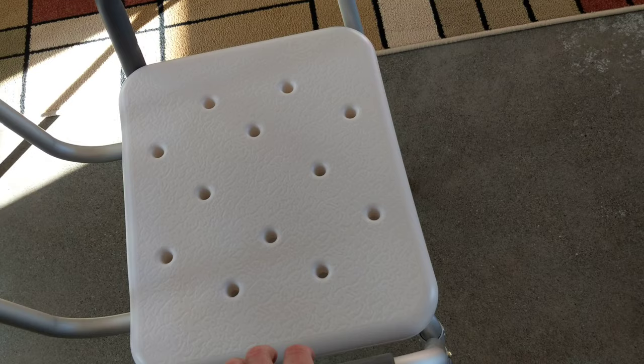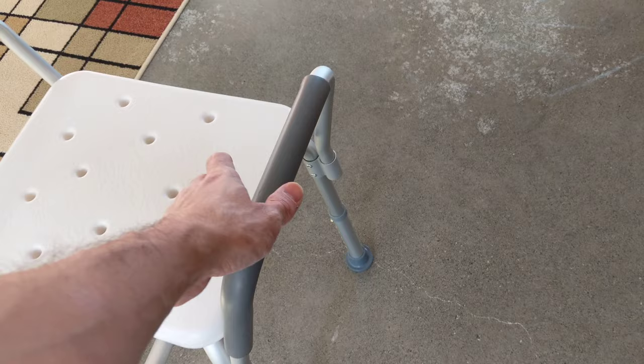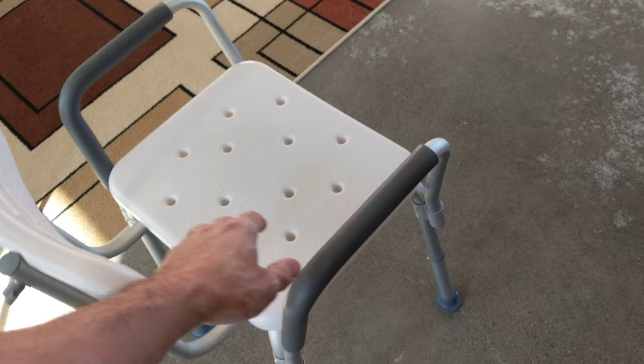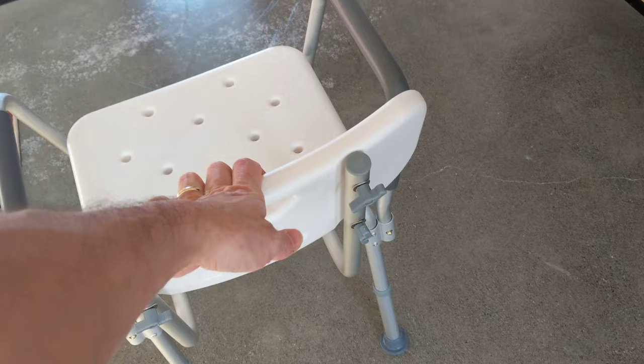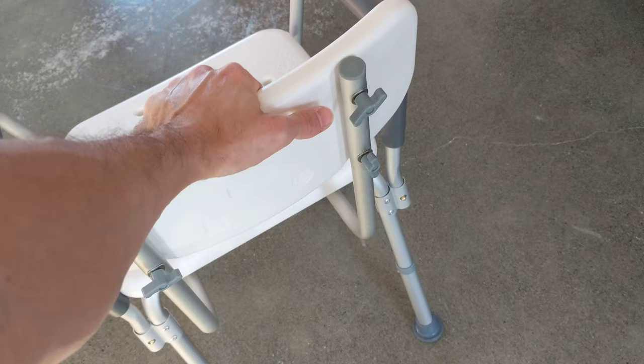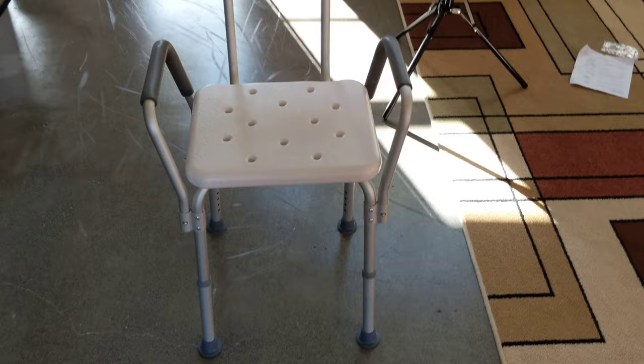Definitely lightweight — you can move it around. I said it was less than 10 pounds, it's probably closer to five. The legs seem like they could be a little bit further out. If you're getting into the shower and using it as a handrail, putting your arm on there, it tends to tip because it's so light — if the legs were out a little more it'd be a little sturdier. But if you're just using it to sit down and get up, it's not bad. You could definitely use it to stabilize yourself getting in and out of the shower. So we're doing a review.